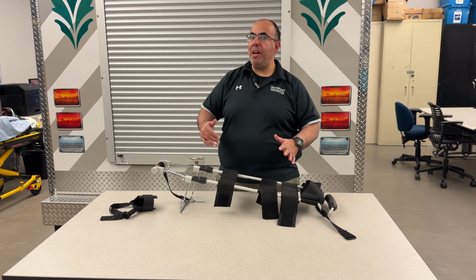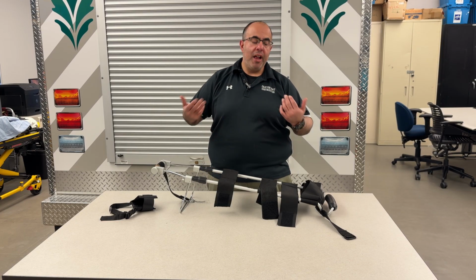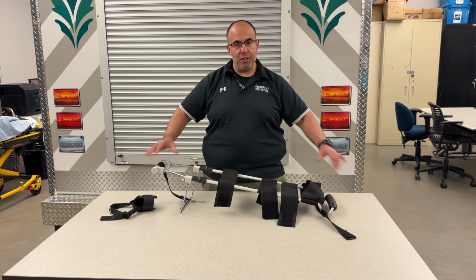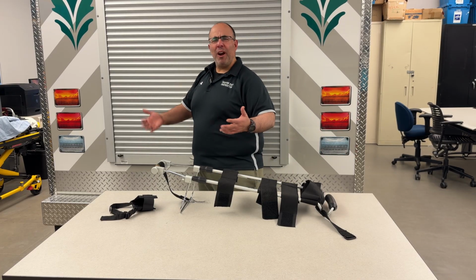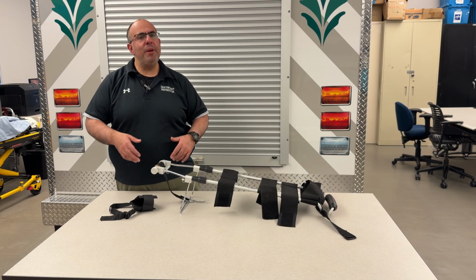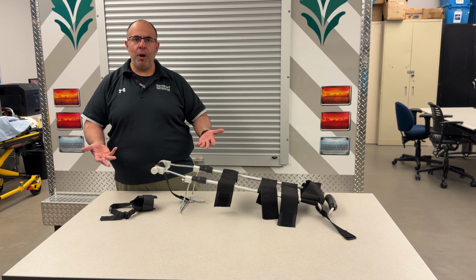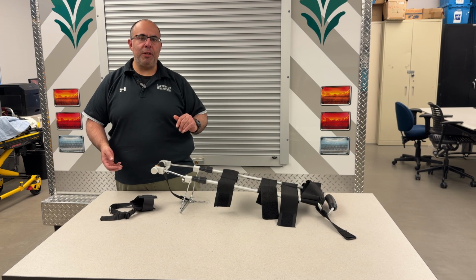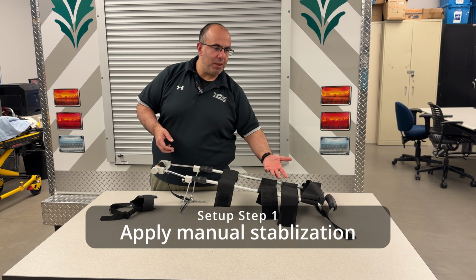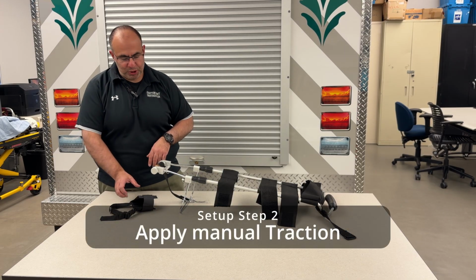Once we've determined our patient has a closed mid-shaft femur fracture, now we talk about the device that we're going to use. We're going to actually use a hair traction splint. Before anything happens, we always make sure our equipment is game ready, but now a few steps occur as you're getting your hair traction splint ready for your patient. One of the rescuers is going to apply manual stabilization, and then they apply manual traction.